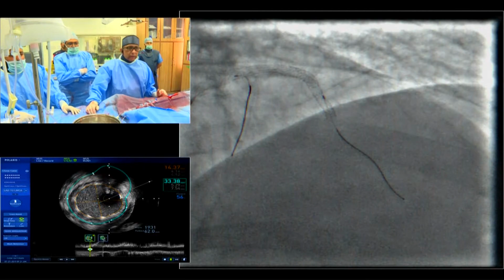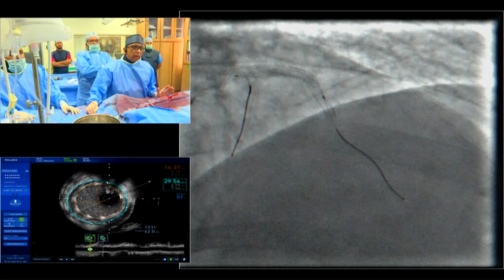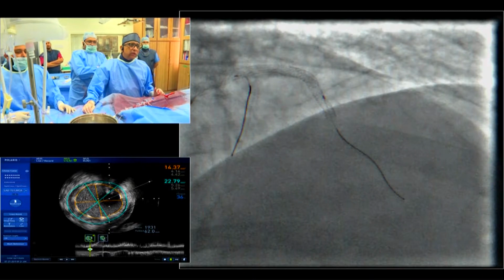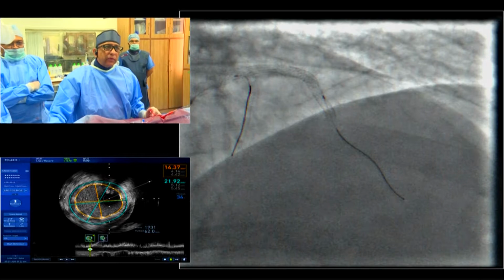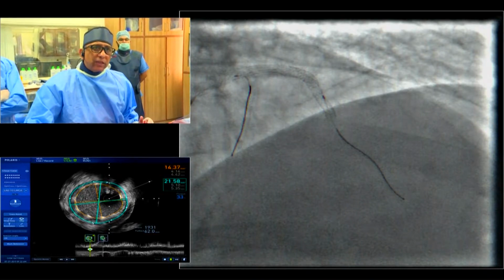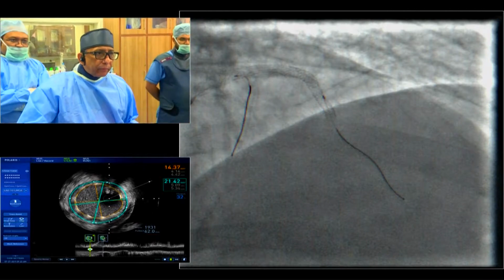No, it's an under-expanded stent. And moreover, a 3.5 stent cannot be pushed to 5 millimeter. There is a chance of disruption of the polymer as well as stent fracture. So I won't go there. Shuvanan, that is the only thing I wanted to explain again.